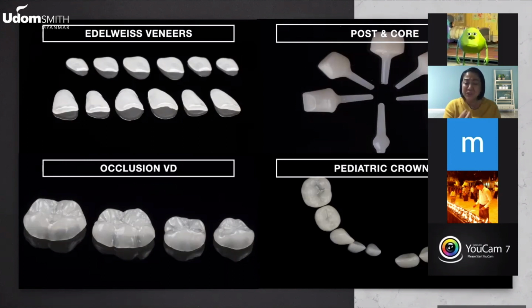Now, what I'm trying to say here is that this material, true, may be more expensive than composite, but at the end of the day, because of the longevity, if we do it right, it will actually become cheaper. So this material will be loved by dentists if the dentist's purpose in practicing dentistry is to save the teeth, or to make sure that the teeth will not be damaged more than they should while we repair them. Because the majority of our treatments tend to damage the tooth first in order for us to treat. This one is the other way around. That's why this material will break first, okay? It will be the one that will fracture first if we do something that is wrong.